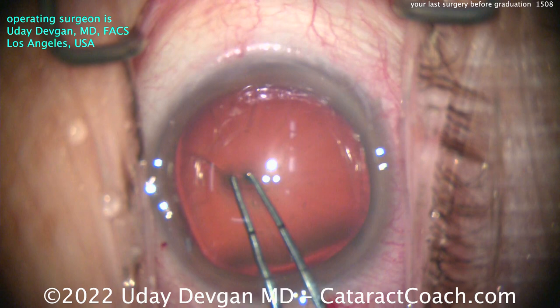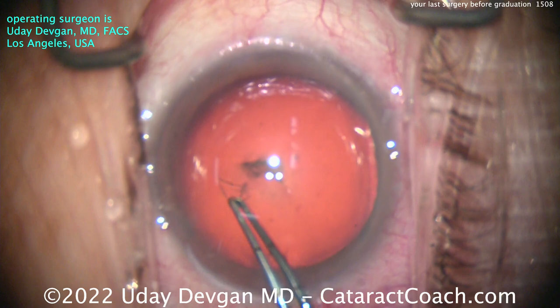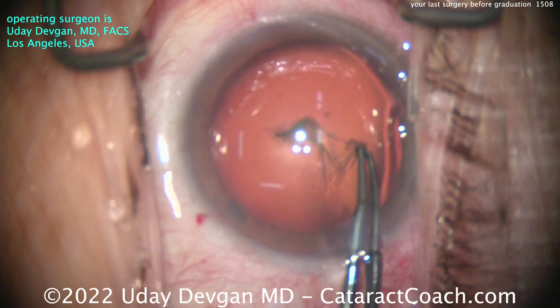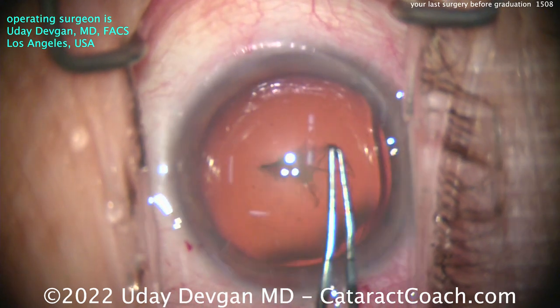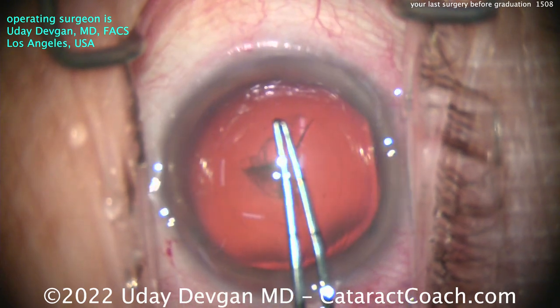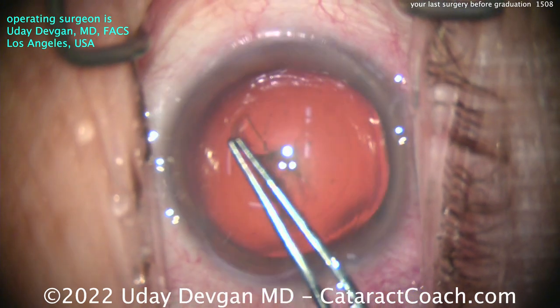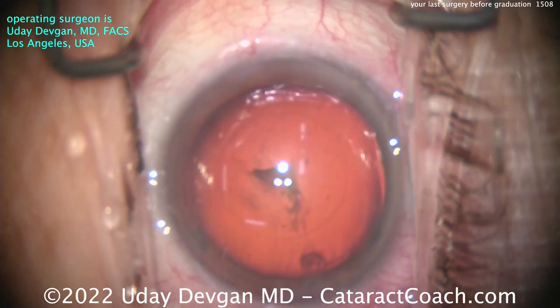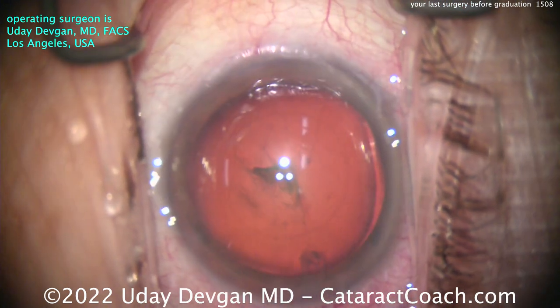Here's the rhexis. A lot of residents have a hard time getting the rhexis done. Let's look at this capsule rhexis. Notice how the instrument floats in the incision — the pivoting technique. The eye stays in primary, not going off your screen. The rhexis is the appropriate size: five millimeters in diameter, nice and round, and well-centered. Look at the Purkinje reflexes in the center of the capsulorhexis — measured five millimeters on the nose. It's a good-looking rhexis.